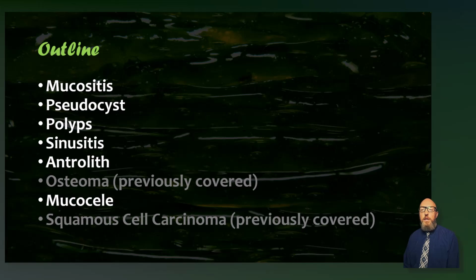This first video is going to cover the normal sinus, mucosal thickenings, mucositis, and retention pseudocysts, the odontogenic lesions that press on the sinus, polyps, and sinusitis. The second video is going to cover the masses: fungal disease, antral osteoma, mucocele, papilloma, and squamous cell carcinoma, along with the rule for when to refer. Osteoma and squamous cell carcinoma you've already met, so those will be callbacks.